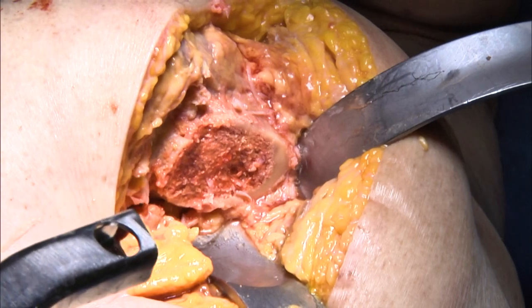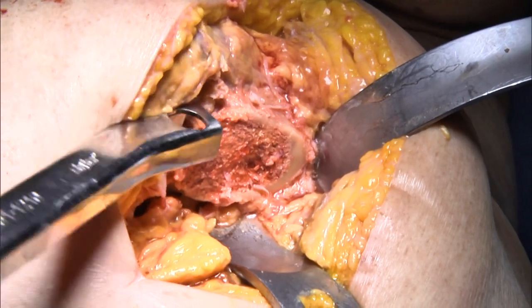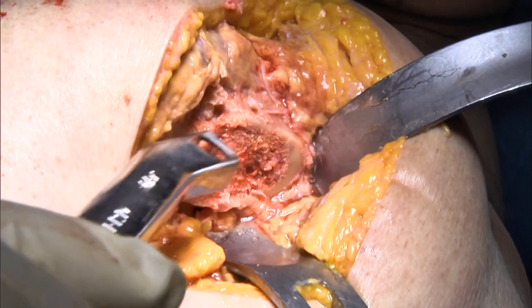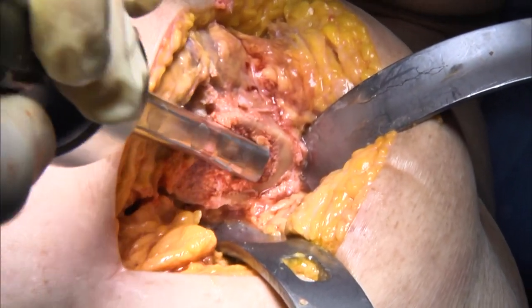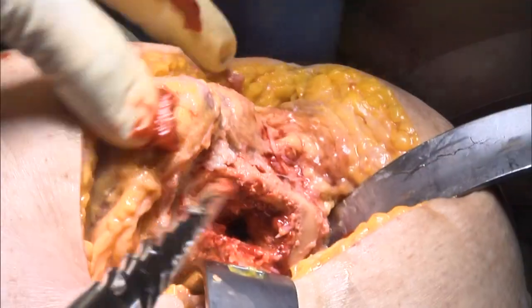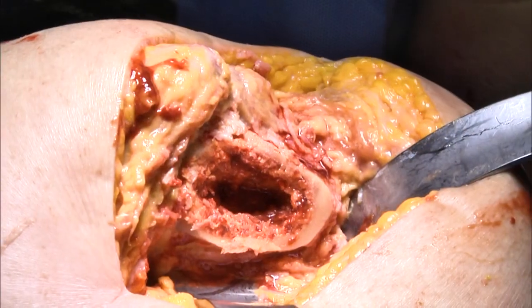The next step is to manually prepare the femoral stem. I do have a sense of my anteversion, so I do plan, and the pre-surgical plans we did, roughly where my box cut will be in order to set my anteversion. There it goes. Yep, now we start broaching.